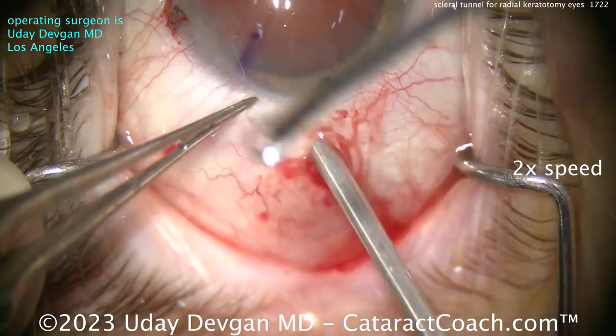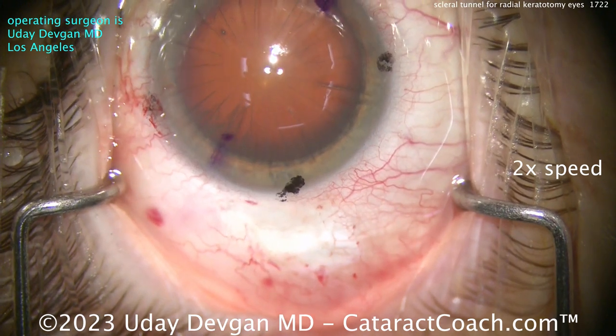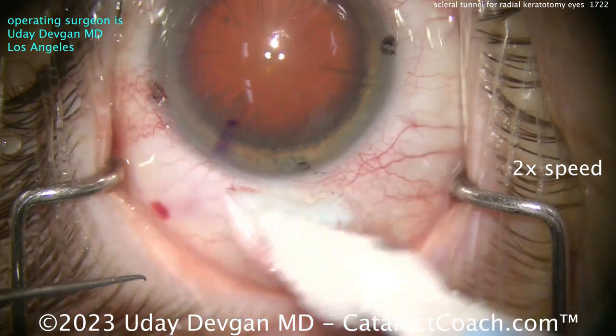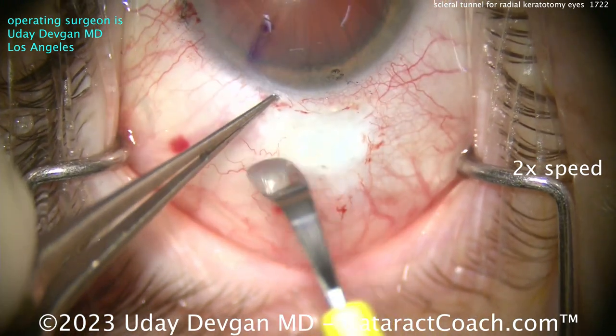Now a little bit of cautery. We've sped the whole video up to about two times normal speed. This case in real life took me about 11 minutes, but we speed it up to twice normal speed so you can view the whole thing in just about five minutes.